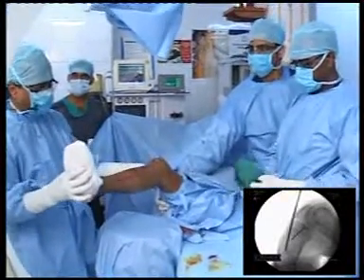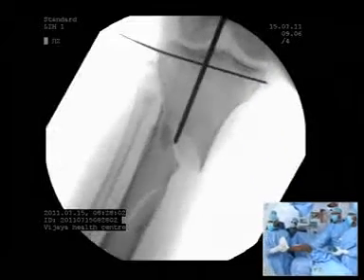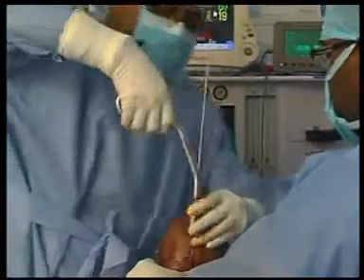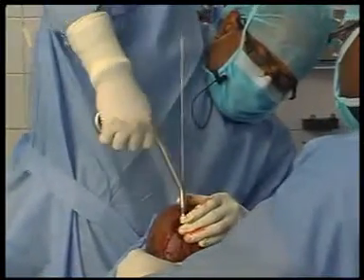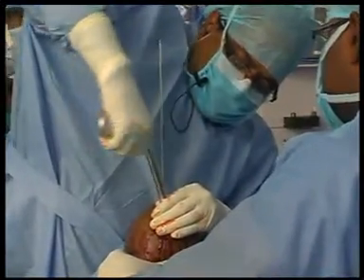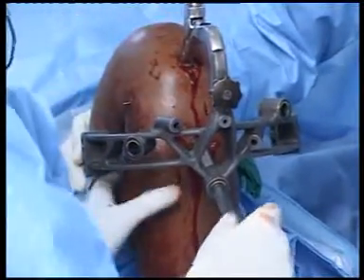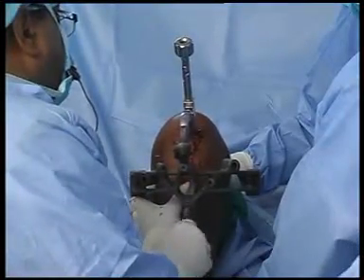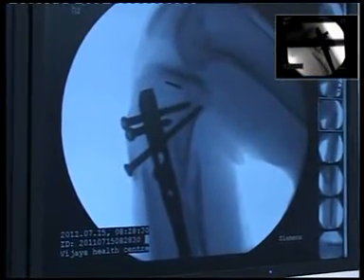That's maximum. I am parallel to the lateral fracture bone in the proximal fragment with the cannulated awl which comes with the set. This is coming just about 5 millimeters above the fracture site, so I will definitely have purchase in the proximal fragment. The K-wire that I had used to fix temporarily — that is the only difference. If we take a picture now — okay, thank you.